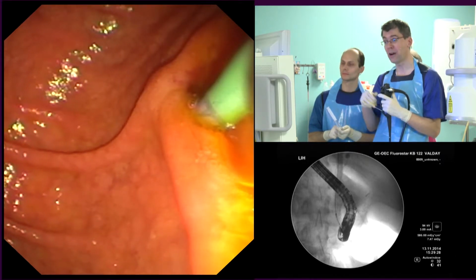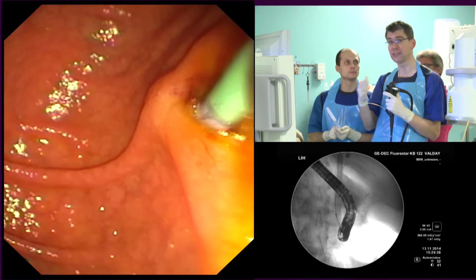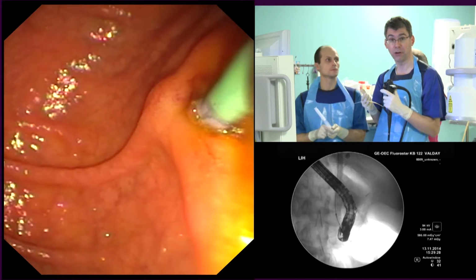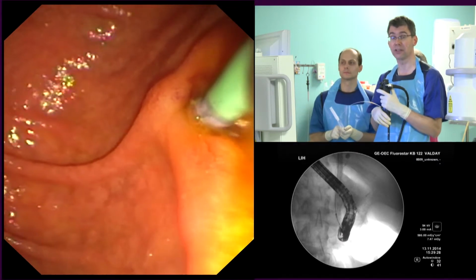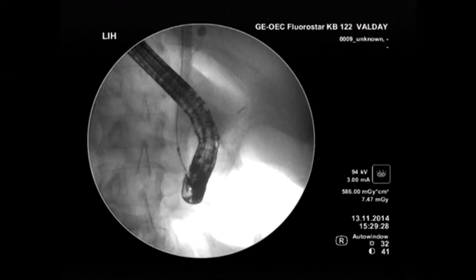So what we do now is we've seen where the problem might be, and now I'll try to take some biopsies. The patient already received brush cytology some time ago, which was so-so, not really without problems. And now what we try is to go for larger biopsies, to take a larger biopsy forceps, enter the bile duct and try to take out proper chunks of the wall.